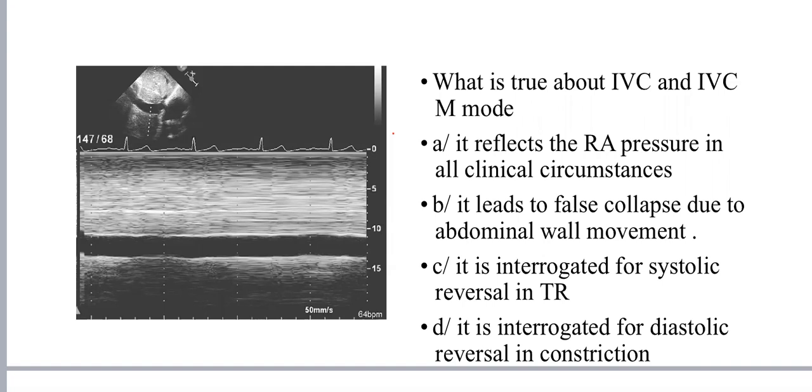Okay, the abdominal wall movement. That's why you have to keep the patient steady as much as possible and ask him to sniff instead of breathing in and out. Okay, so don't lose the image while you are scanning from the abdomen.